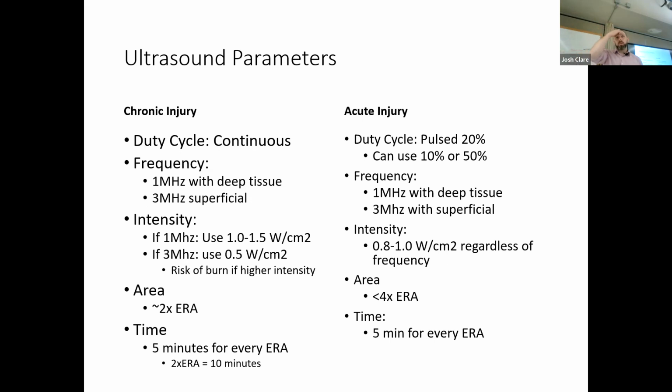Do you have a question, Michelle? Do this because you're getting so much more of the involved area, or would it not harm it? As long as we're not over bony prominences, then it's okay if we go bigger. Let's say I want to do pulsed, but I'm really focal. I can keep this in a small area as long as I'm constantly moving the sound head. I will be okay.